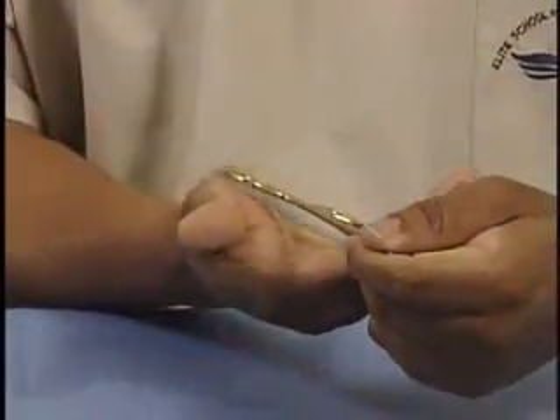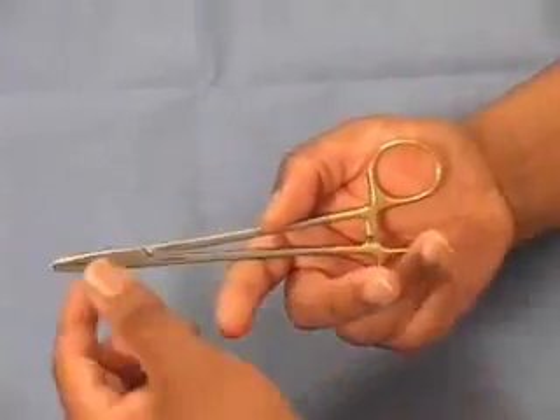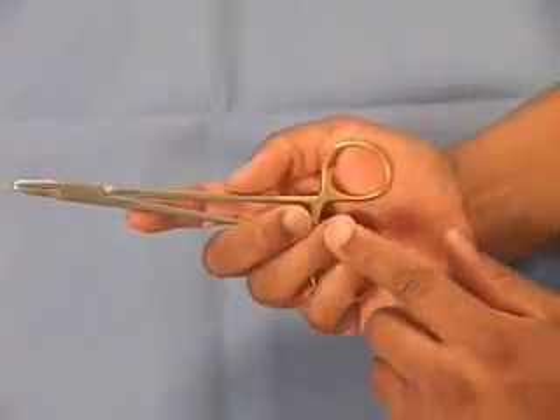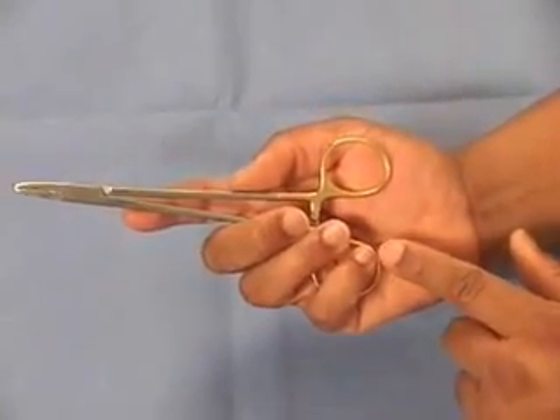Now let's look at the palming method to control the needle holder. The upper ring goes on the pad of the thumb. The index finger will again be applied to the shaft or body of the needle holder. The pinky, ring finger, and middle finger will be applied to the lower ring.